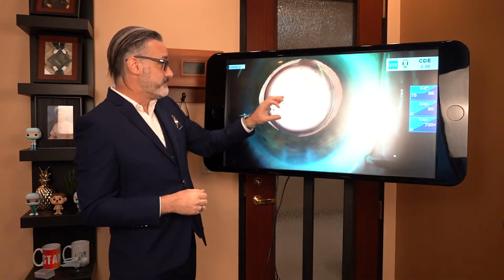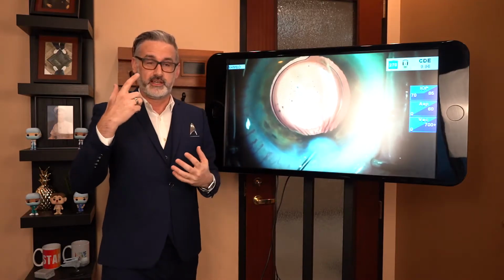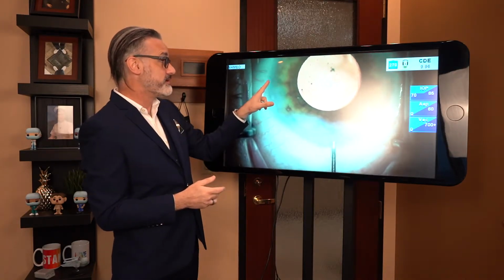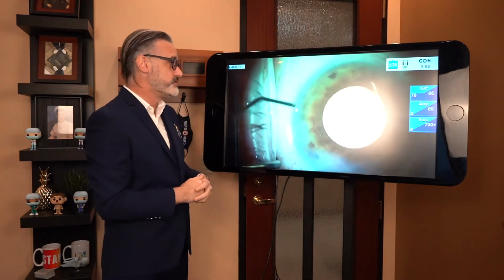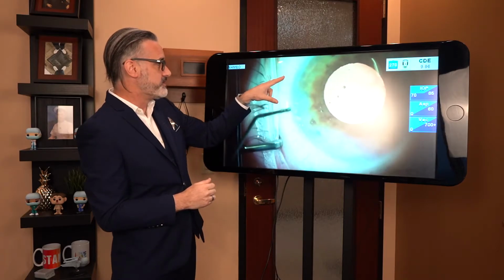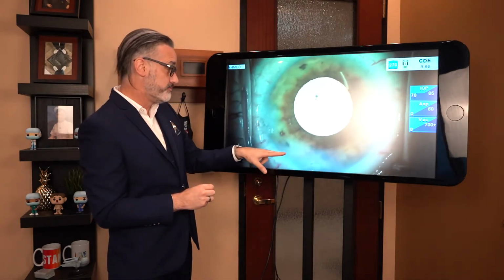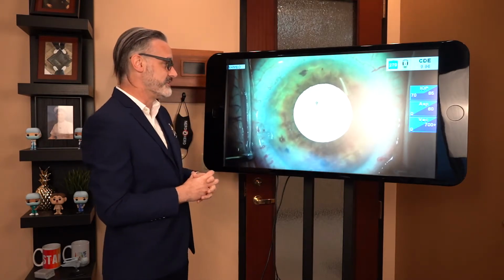And then as the doctor puts the lens in, now it's not just like putting a contact in where you just pop them in and pop them out. When the new lens goes in, now the provider has to make sure and go all the way around that the lens itself is connected to the eye, and the provider is just going around, making sure that's all connected in there. And then they can double check their work with the kind of little spongy type of material to push it through to make sure that all of the lens was connected correctly and none of it was left out.